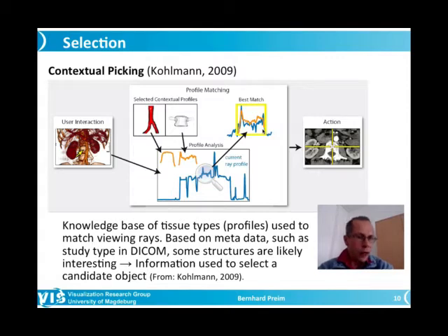I have not tried this system myself. I guess it works in most cases quite well, a little bit like our approach. It will not work perfectly in 100% of the cases. That cannot be expected since the anatomical variability is just too large. So probably in addition, this pop-up menu idea of presenting the objects that are at a particular point may help in cases where this approach does not select the intended structure.